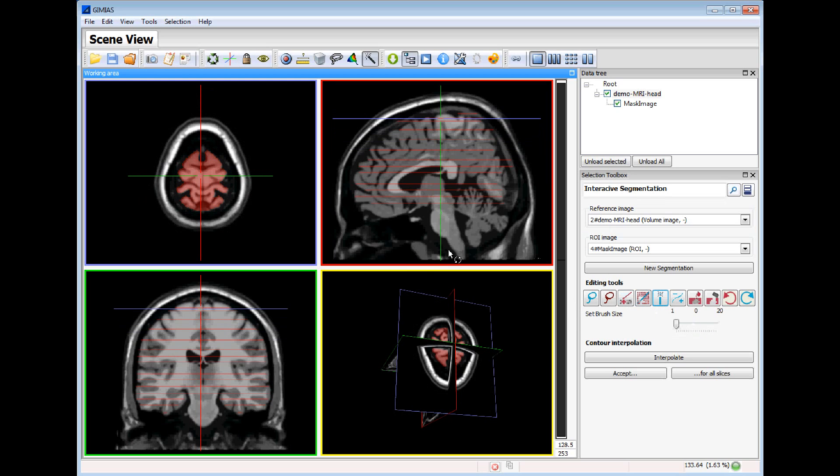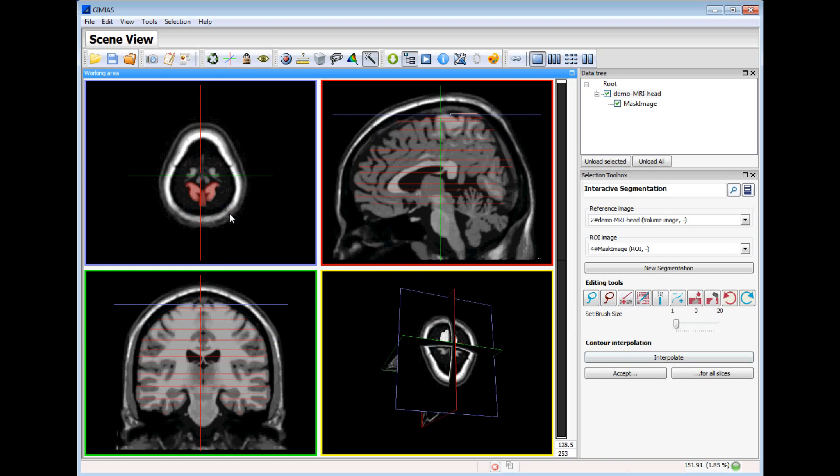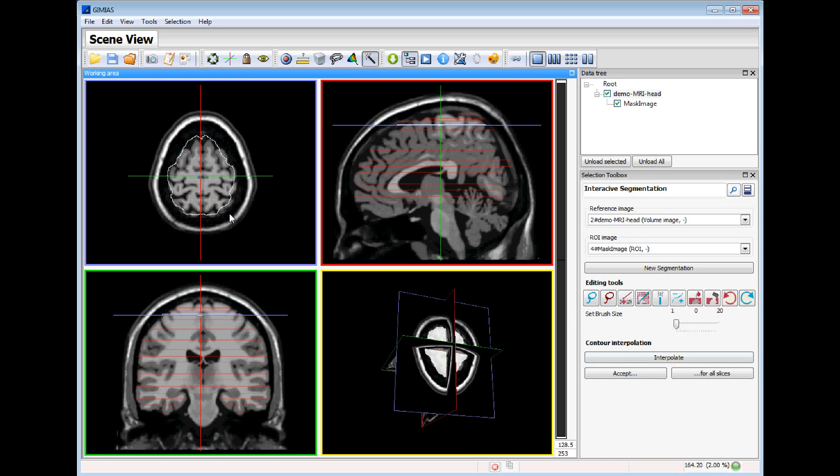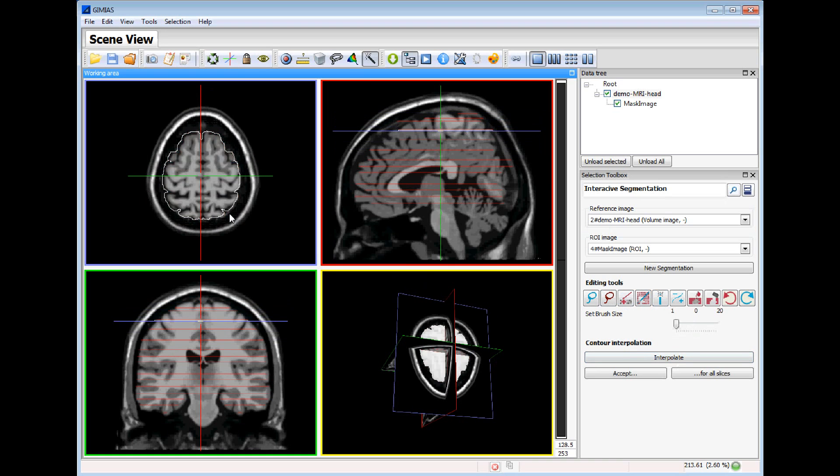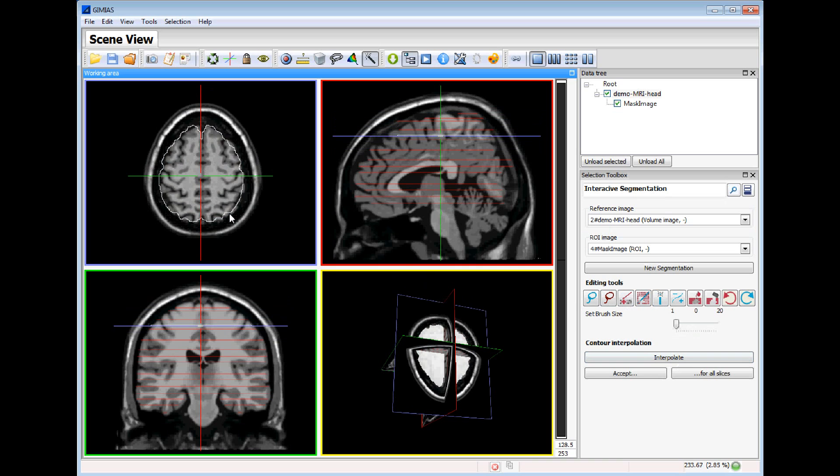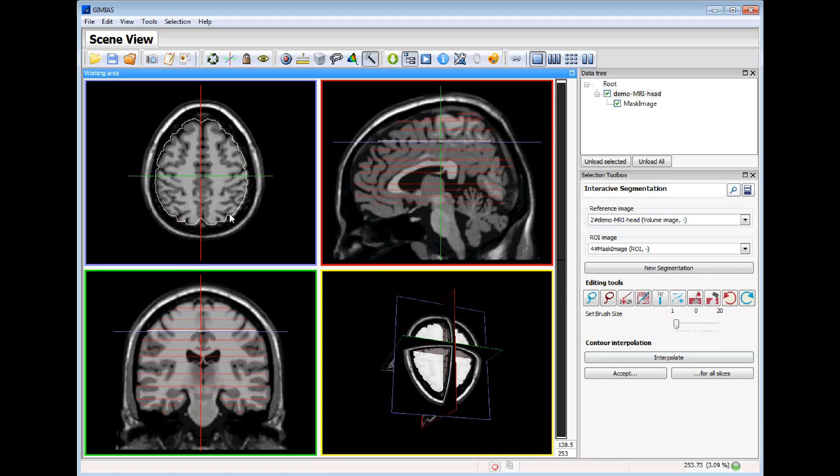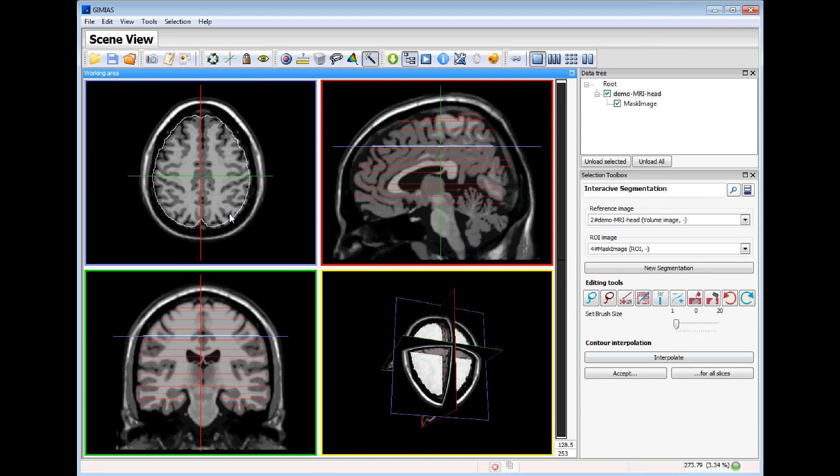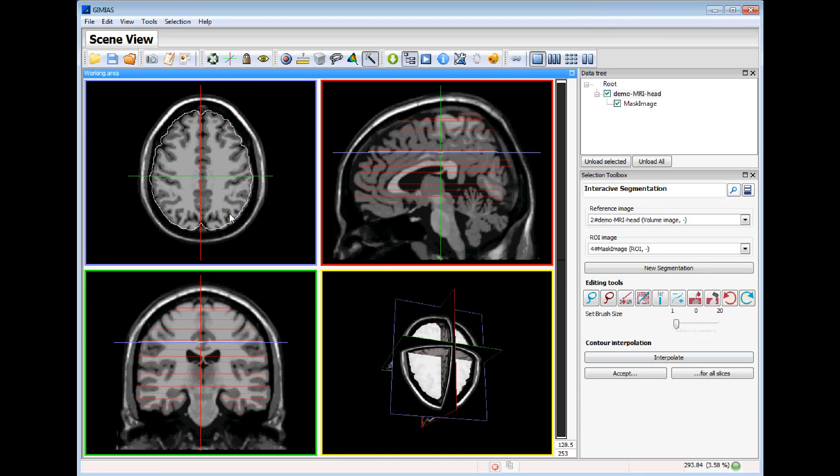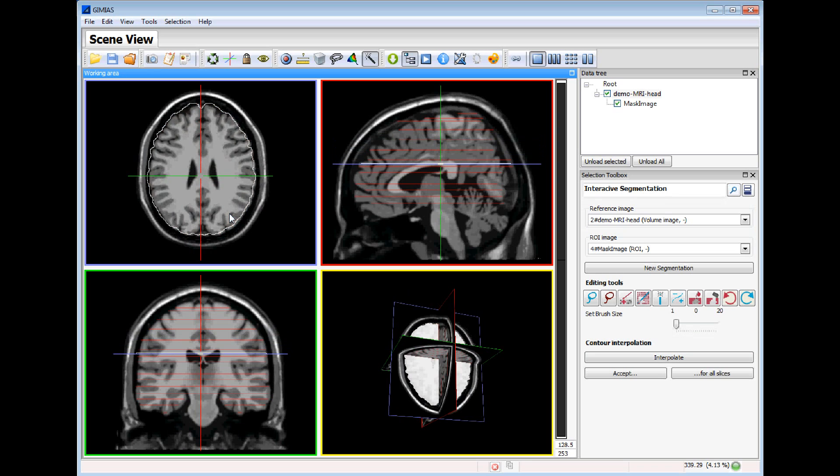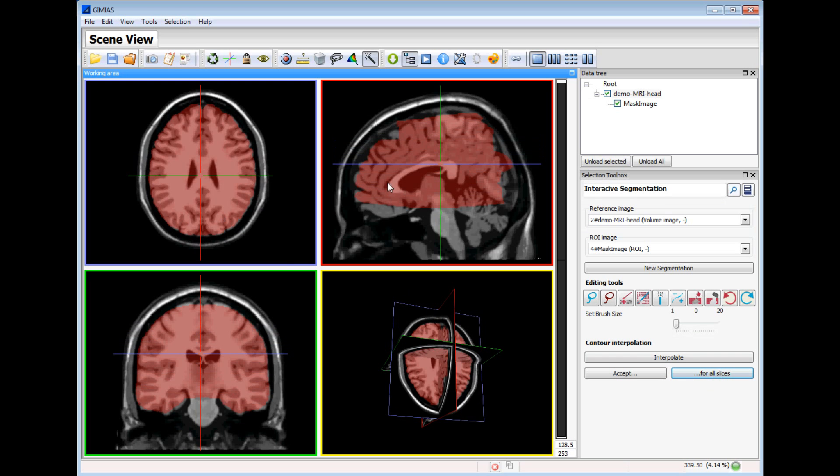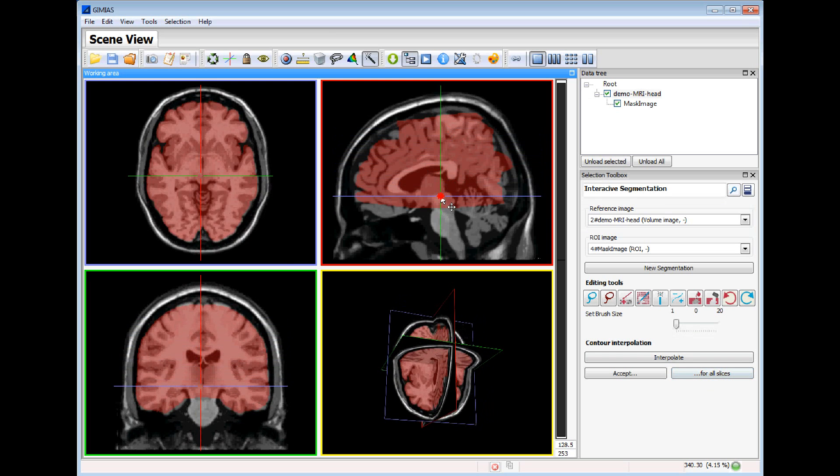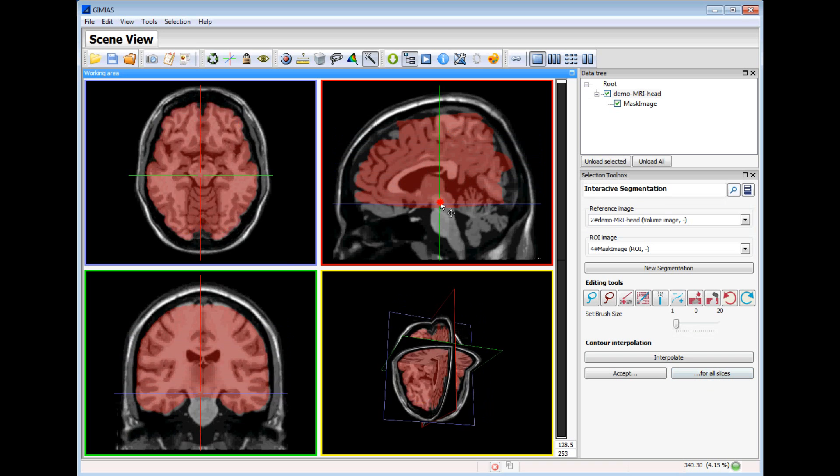Once all the slices are segmented then I can use the interpolate function. This will create a white contour interpolated over the slices that are not segmented manually. If I agree with all this automatic segmentation I can apply for all the slices. Now you can see that all the slices are segmented.